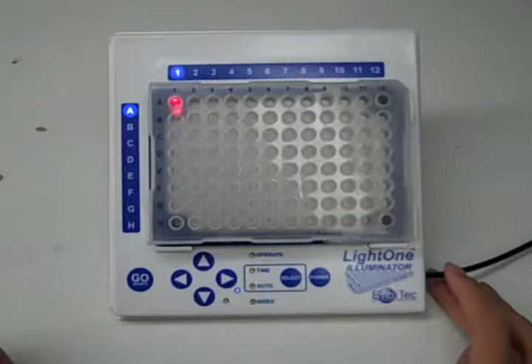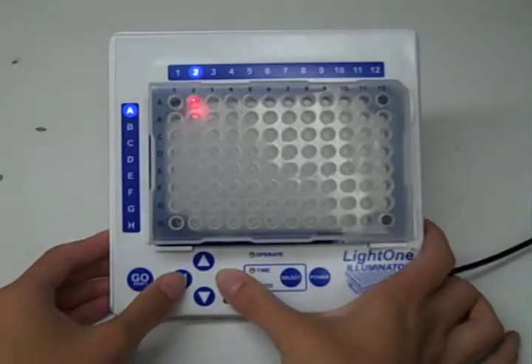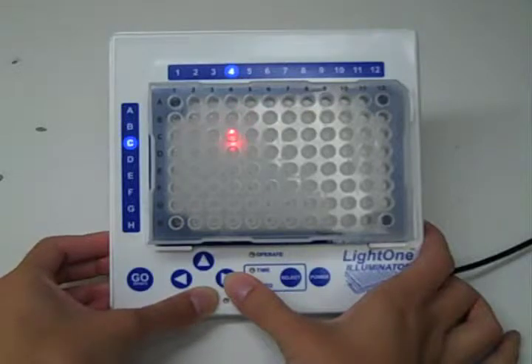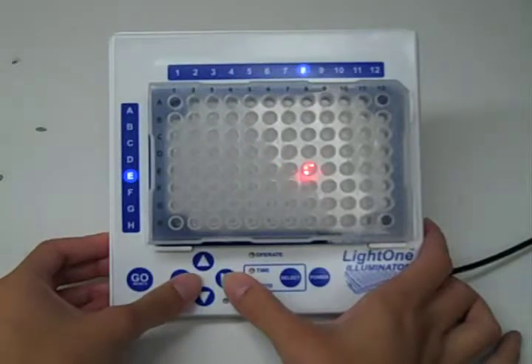The Q Red starts with Manual Mode. You can navigate and move the light around by using the directional arrows, and basically you toggle to the well you want to go to.